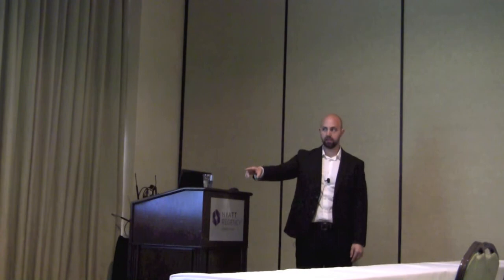It doesn't work. But protect your clothes, protect yourself, wear nitrile gloves, safety glasses, even a mask if you have something that has a high solvent content in it, a lot of fumes. Now, the ideal print environment, I cannot stress this enough, is a clean environment. I know laboratories can be dirty, they can be dusty. Put a ventilation system in, or a filtration system to try to get those dust particles out of your print room, and try to keep it as clean as possible. An emergency eye wash station would be ideal if you could actually make that happen. Learning institutions do have access to that. And if you get resin in your eyes, you're really going to want to use that.